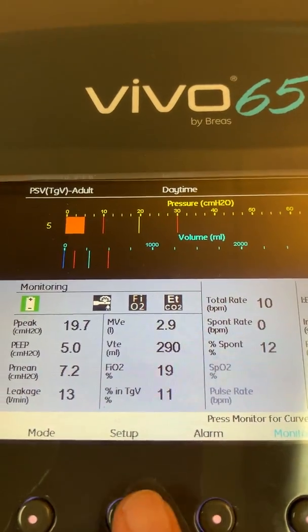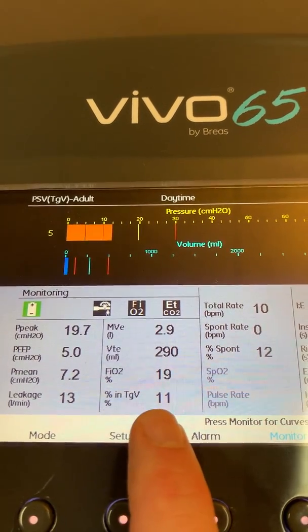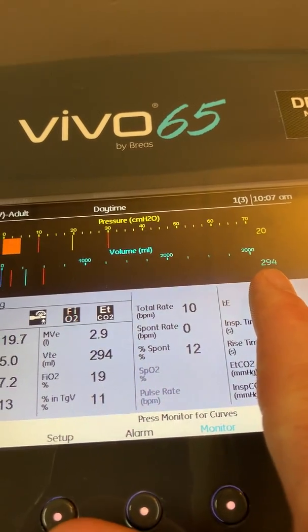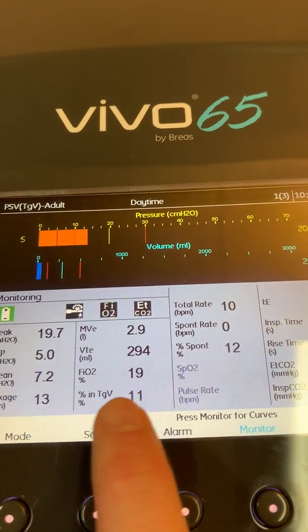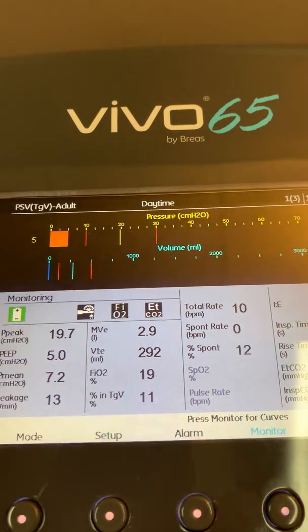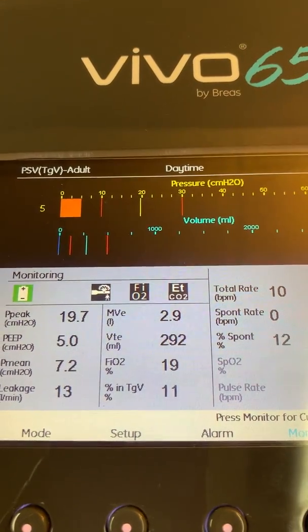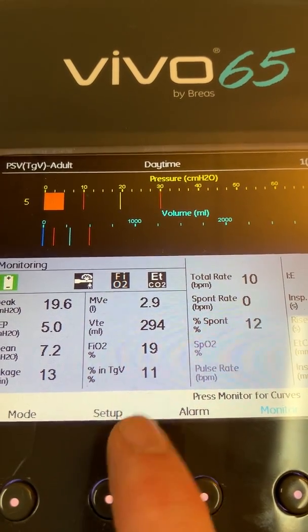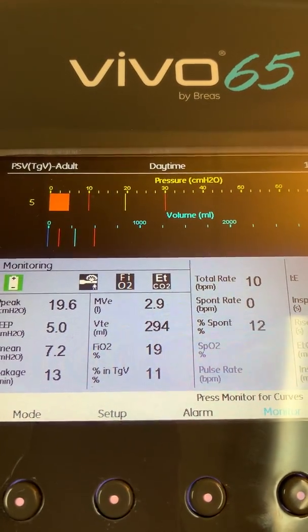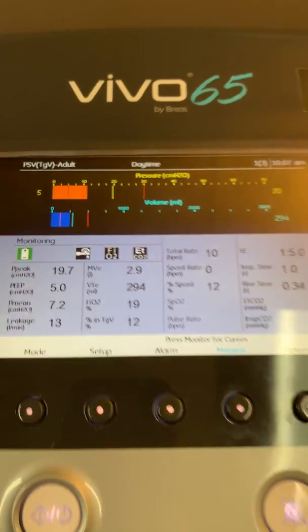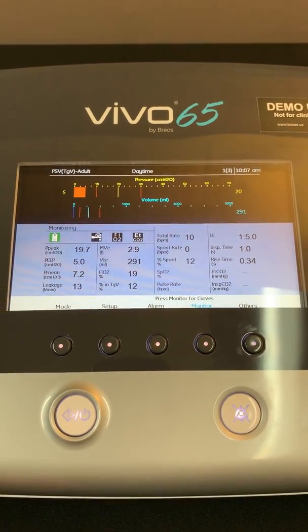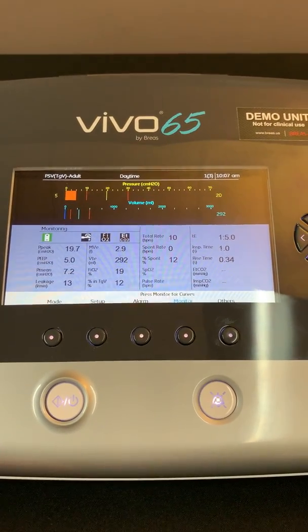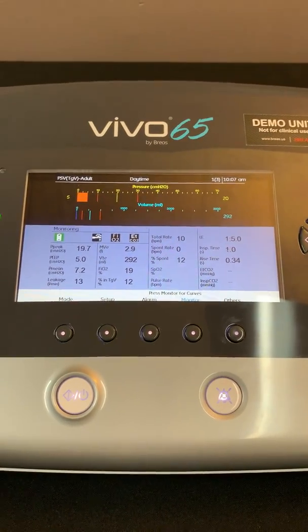Taking one last look at the percent and target volume: the more often the patient hits the target volume goal, the higher that percentage climbs. The Vivo 65 gives you a percentage of how often the patient is hitting the target volume goal when that feature is in use. That concludes the quick overview of the main monitoring screen. Thank you very much for your time.